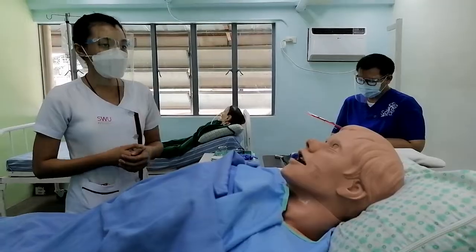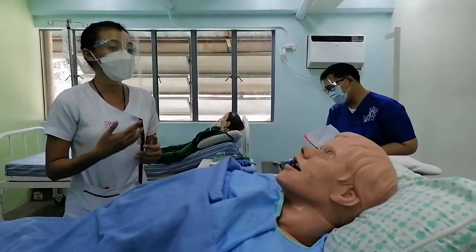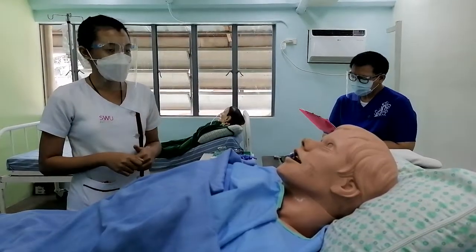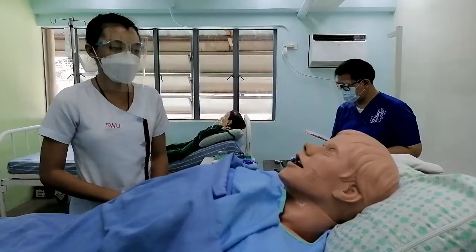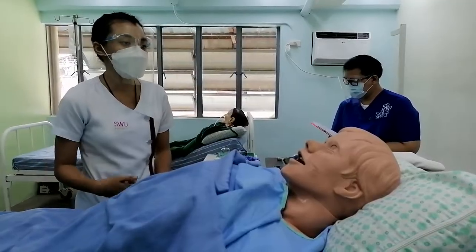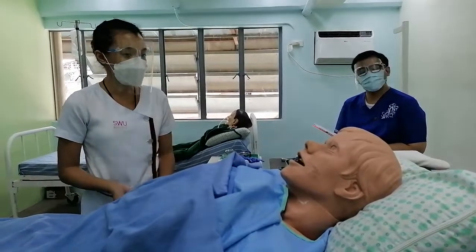Then after explaining the procedure to the patient, I will inform the patient about non-verbal cues, since we know that nasogastric tube insertion is very uncomfortable. So sir, this will be very uncomfortable for you. That's why I request you to at least tap the side of my shirt or raise your thumb if ever you feel uncomfortable, because we need to consider the patient's comfort as well.